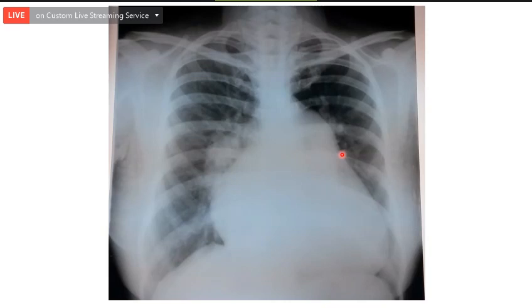Okay, yes. What else? What are the X-ray chest PA view evidences of left atrial enlargement? So double contour of the right border. Double density sign. It is early enlargement. Yes. Shadow through shadow, you are seeing increased double density. Shadow through shadow is another evidence of left atrial enlargement. Okay. Third.